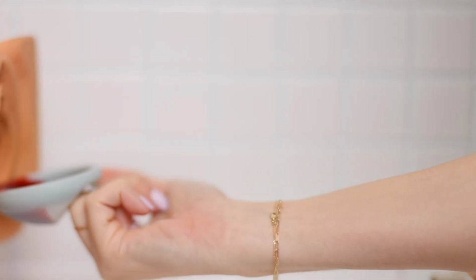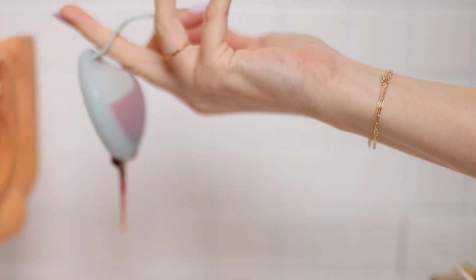There are ways around this. You want to pull it up to navigate it, block that so it goes backwards away from your hand. Always do this in the shower the first time you're ever removing a menstrual disc. That is a pro tip. So yes, you're getting in there. You're getting in there to put it in. You're getting in there to remove it. It is just more involved with your own anatomy.